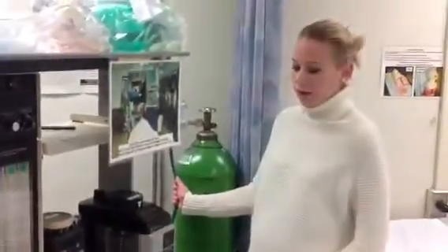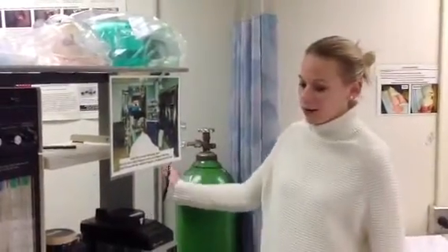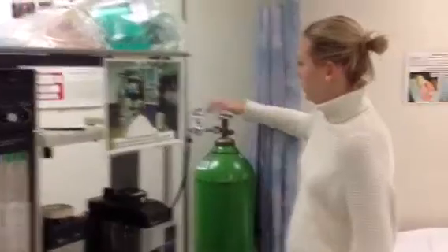Then you're going to go and check all your pipeline connections. So green goes to oxygen, yellow to air, blue to nitrous. Make sure that it's on, and then go to your pipeline pressures on the machine and make sure they all read 50. Okay? So that's the high pressure check.